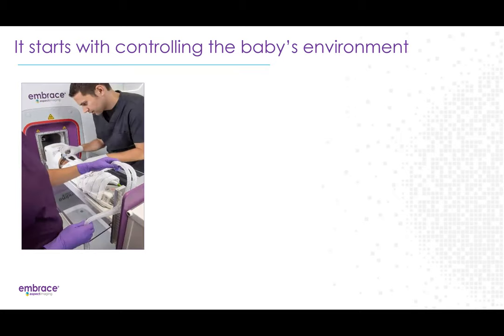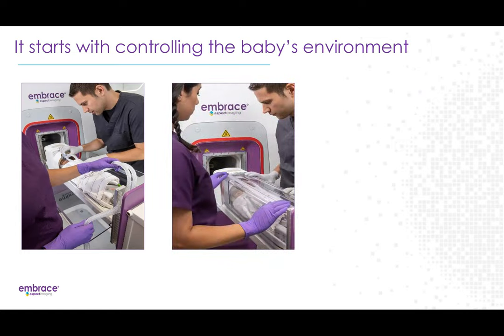You can see here in this photo on the left, the door is open on one side. The nurse is actually routing the respiratory circuits through the channel there at the end of the bed. Those are the cable management systems that allow you to run IV lines, respiratory support, all of the necessary equipment out of the bed and out of the magnet to safely continue their use during a scan. And then the doors are closed. As you can see, even with the doors fully closed, you keep full visibility of the baby while you are prepping to move the baby into the magnet.